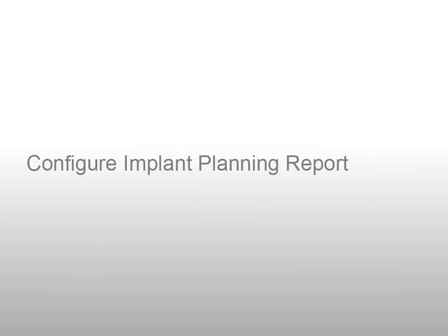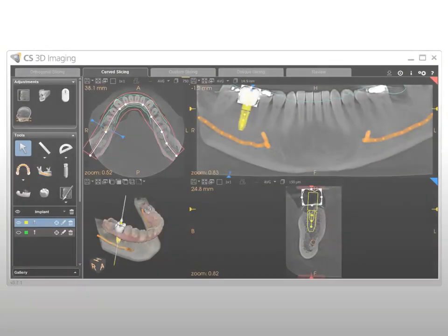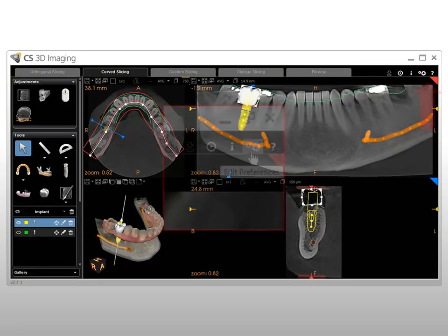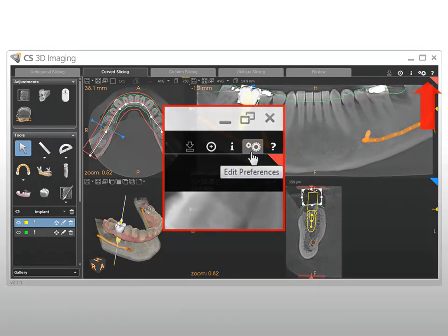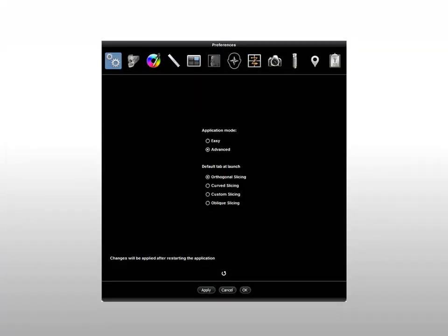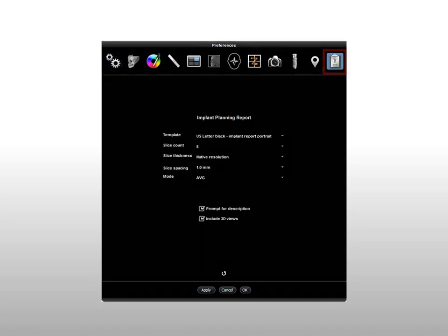To configure the Implant Planning Report preferences, on the Curve Slicing tab, click the Preferences button. The Preferences window is displayed. Click the Implant Planning Report button to access the report preferences. In the Implant Planning Report Preferences window, select the Output Options — Template, Format (A4 or U.S. Letter), Orientation (Landscape or Portrait), and Background Color (Black or White).